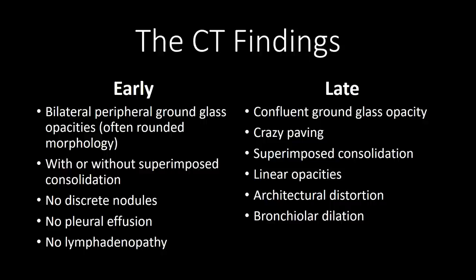Crazy paving is being reported, which is a pattern within the ground glass opacification where there is also septal line thickening that creates the look of stone pavers. Later in the disease, consolidation is more commonly reported, superimposed on areas of ground glass opacification. There are also linear opacities developing later in the disease associated with architectural distortion, and bronchiolar dilation within the areas of opacification.